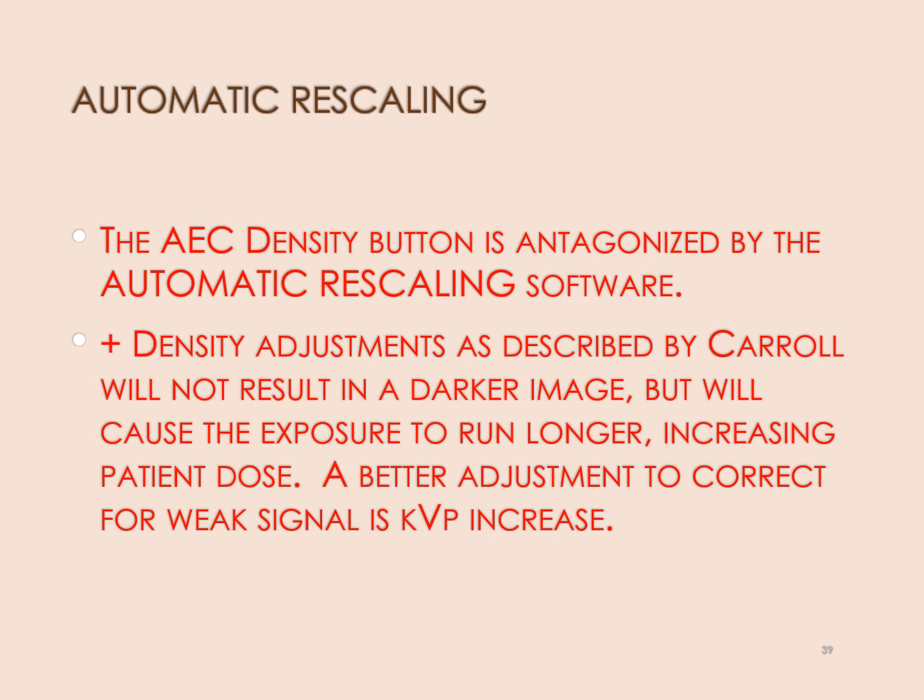The exposure will run longer, and you will increase patient dose, but your image will not get darker. Your remnant beam strength will be stronger, but that doesn't translate to any visual parameters. Brightness and contrast are set by the software, not by the signal strength. Okay? So a better adjustment to correct for weak signal in the digital age, instead of density plus, increase your KVP instead.